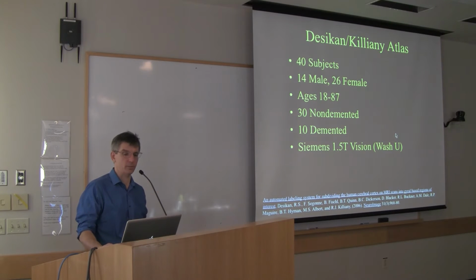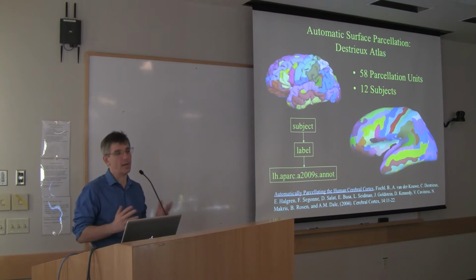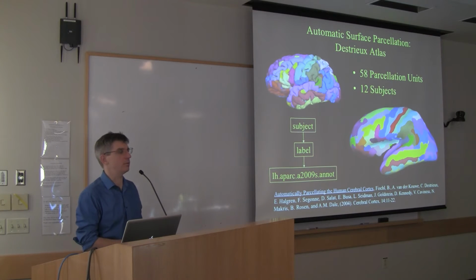these mappings are pretty good, regardless of the fact that the subjects used to generate the atlas might not match your individual study all that well. There is another atlas. So we have all kinds of ROIs. As I mentioned before, we have all kinds of data. It's a very rich data set that FreeSurfer generates to characterize your subjects on an ROI basis.